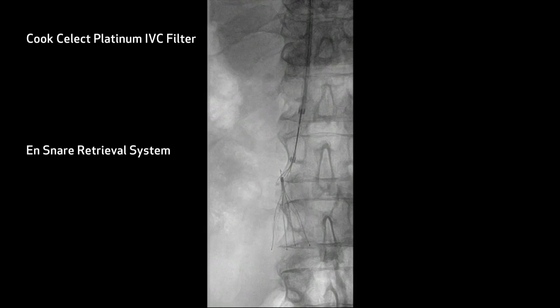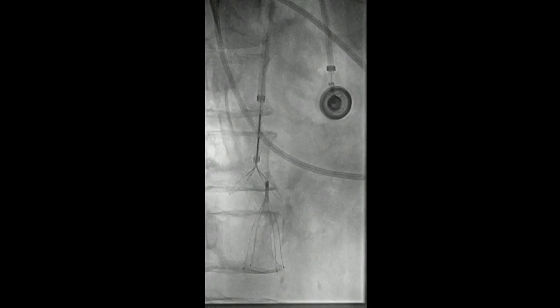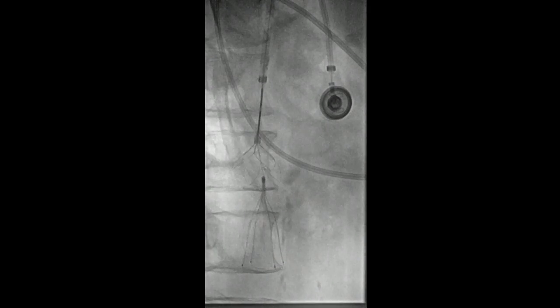What we want to do is bring a wire up from below, and we're going to try and place this on the right side of the inferior vena cava with a balloon to see if we can move that hook off the wall so that we can capture it with the end snare. Again, we've looked at it in multiple different views, still not even really touching the hook.